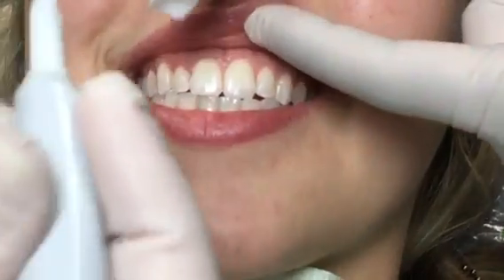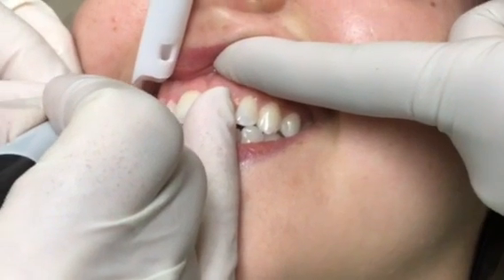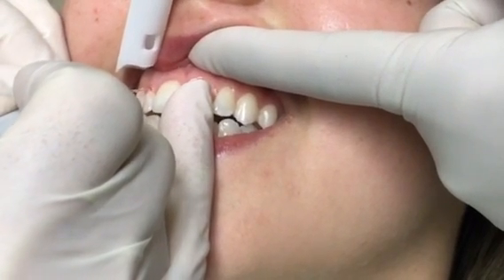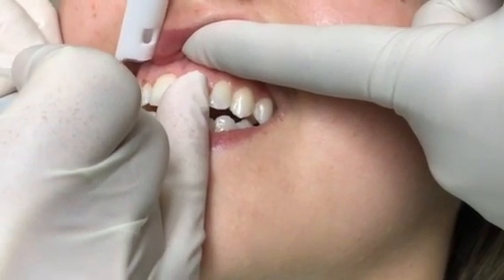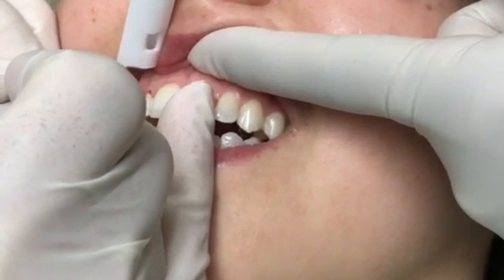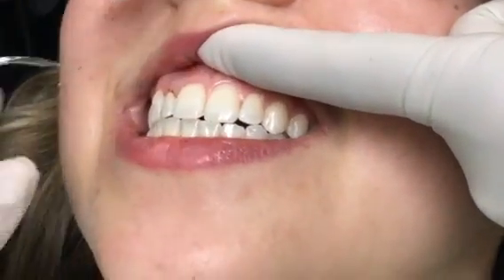Let's just stay on with the patient. The laser is a very small device. We're going to go ahead and just remove some gum tissue here. And as you can see, I'm just simply removing — it's like an eraser. It's done with heat, and we're just going to remove a little bit of gum tissue at a time.